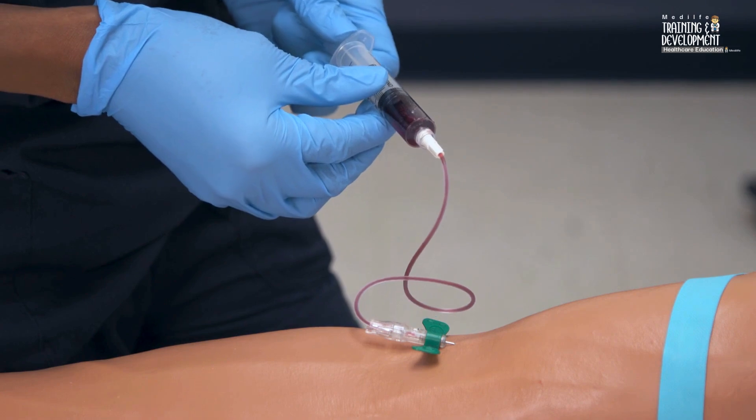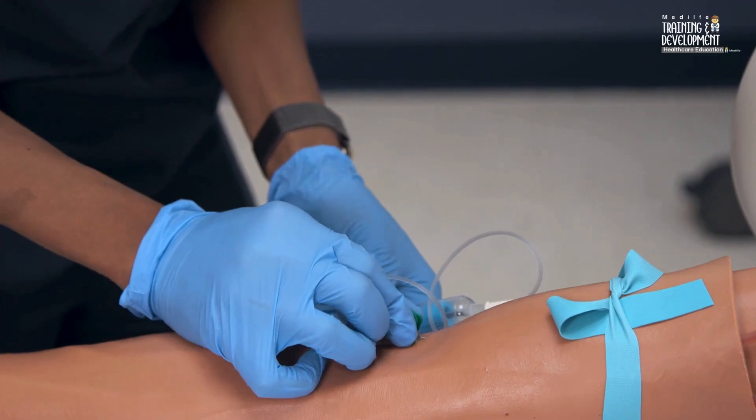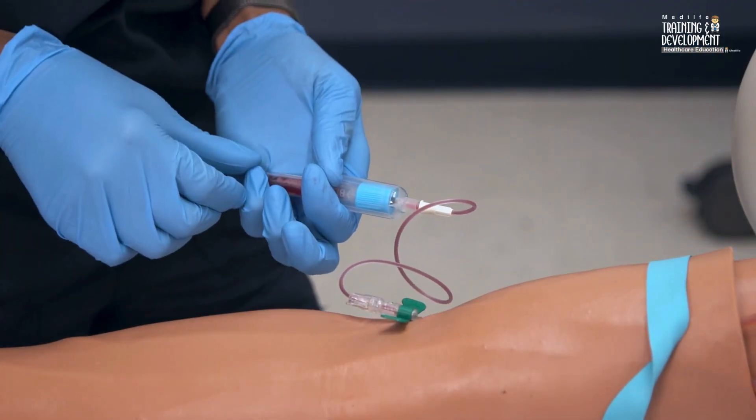If you're using a needle holder and an evacuated tube, grasp the holder securely to stabilize it in the vein and push down on the collection tube until the needle punctures the rubber stopper. Blood will flow into the tube automatically.